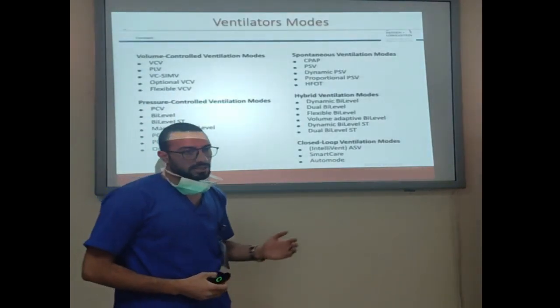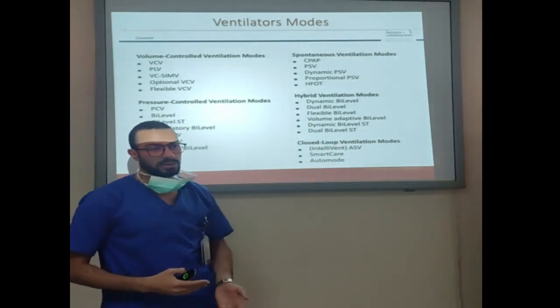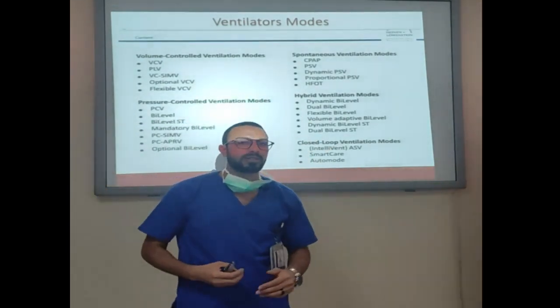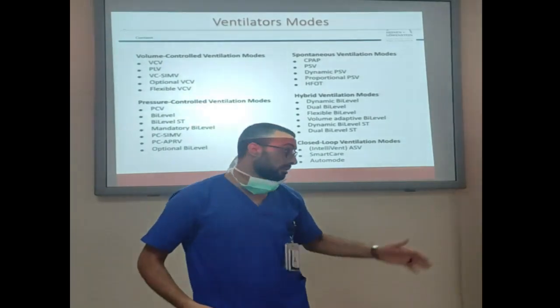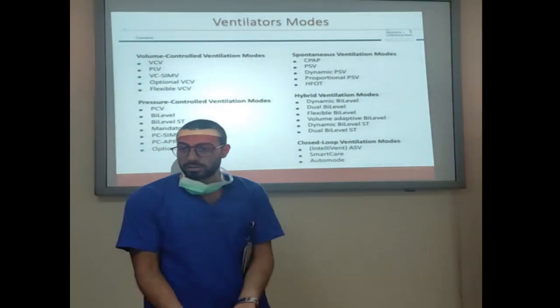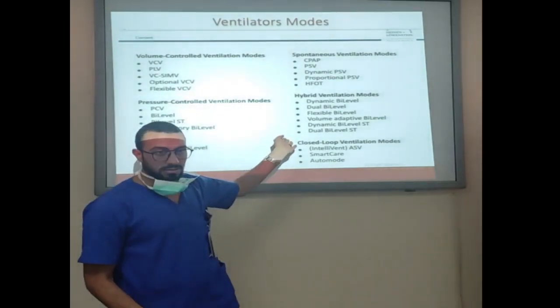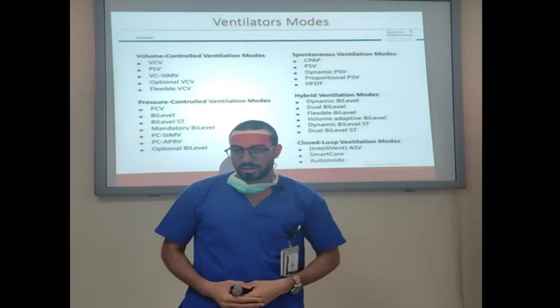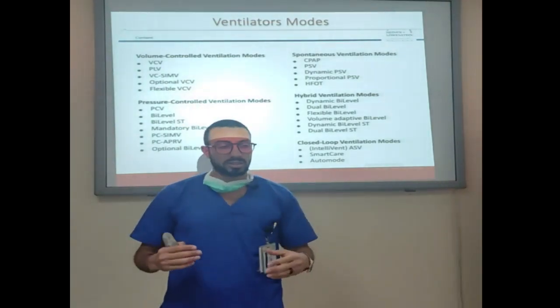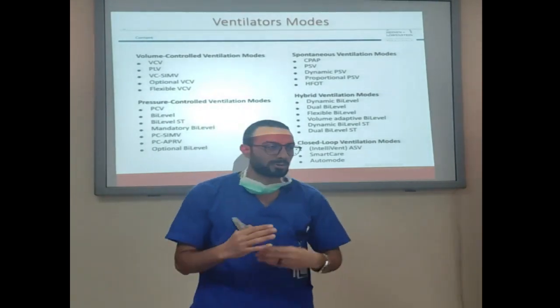Ventilator modes, as you see, are too many, but I will not explain everything, because it's very advanced and sophisticated. These days we have more than this in some devices, like the Hamilton in our hospital. It has some modes more than this, because Hamilton is very advanced. It has an adjusting mode, so it can adjust itself to the patient according to the case.